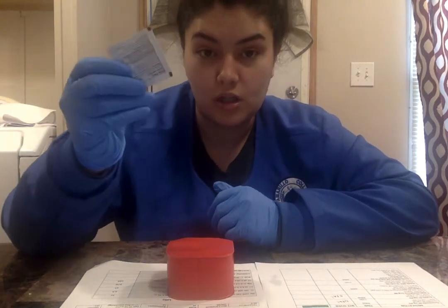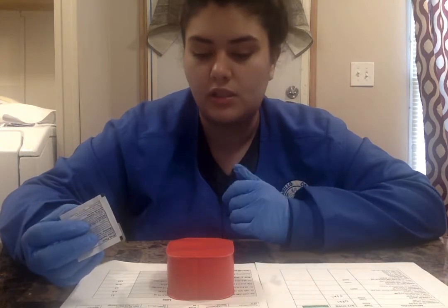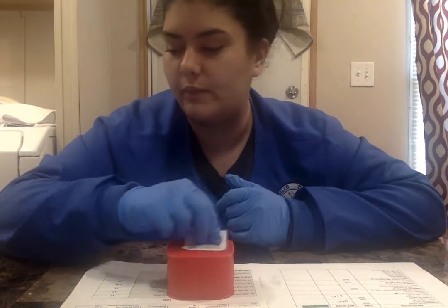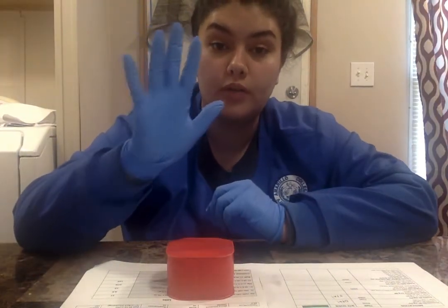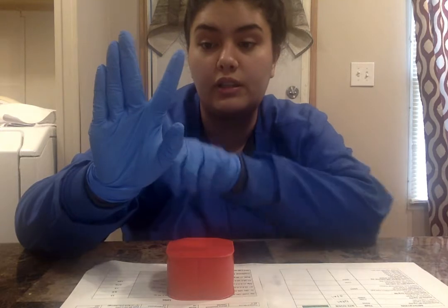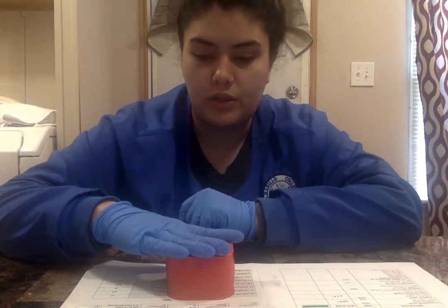I'm going to get an alcohol swab. I'm going to tell her, Miss Lano, this is going into your ventrogluteal muscle. She says that's fine. I'm going to swab her ventrogluteal area with alcohol and make sure that's real nice and clean. I'm going to put my palm on the greater trochanter and point my fingers up towards the iliac crest. Then I'm going to open my pointer finger, pointing towards the anterior iliac crest, and deep within the V I'm going to inject my medication. So I'm going to go ahead and do that.